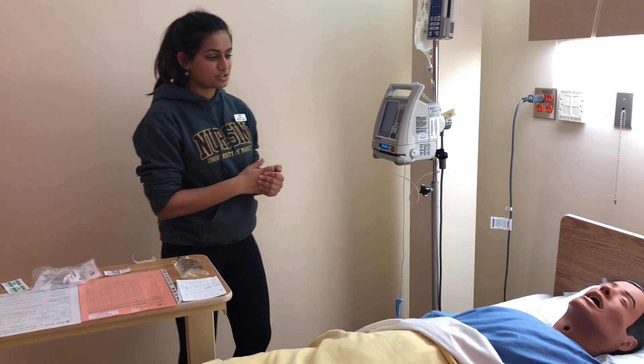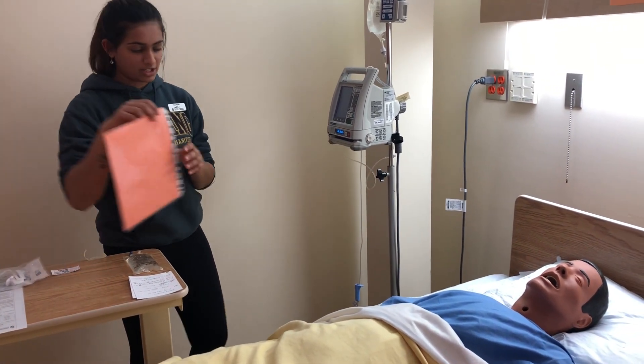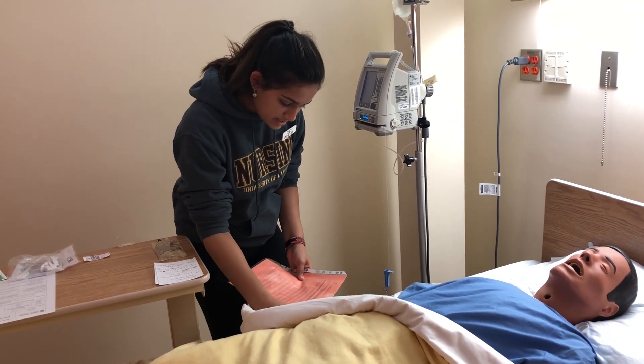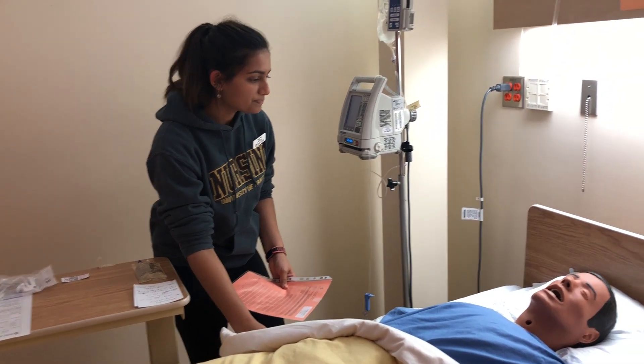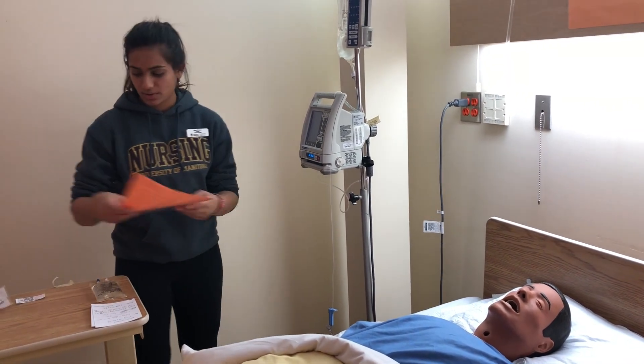I'm going to introduce myself: Hi, I'm Grace, I'm your student nurse, and I'm here to administer your methylprednisolone medication. I'm just going to check your armband. It's Emma Wrightson, 30 years old, Dr. Nichols, allergy to morphine. Can you tell me your name and your date of birth? And do you have any allergies? — to morphine specifically.